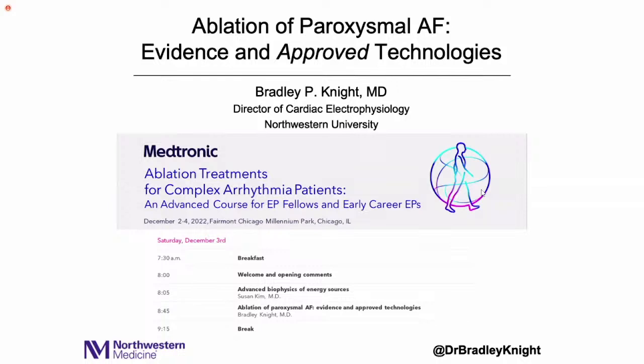I'll definitely make it shorter, and then I avoid, on the ridge or in front of the right side of veins, I'll go for big contact force, but I will shy away and try to stay closer to 10, 12, not really go over 15.